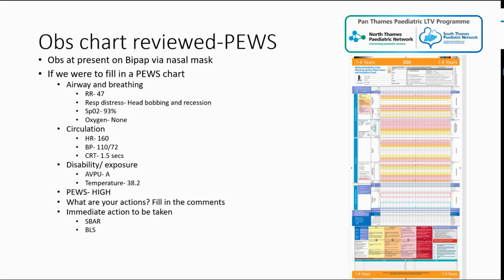It's great that people are starting to think we've got to give oxygen, paracetamol, needs to get onto wet circuit. Well done for seeing that. Unwell settings, as we've just said, they might have that. So brilliant. Respiratory action plan, yes, brilliant. Unfortunately, the physio plans aren't as neat and organized as the RAPs that they have for nurse and doctor settings, and we're hoping to review that and make a change in the future. Put on the wet circuit, oxygen, cover for infection. Yep, we'll be thinking about that, what's going on there, review and response to this.